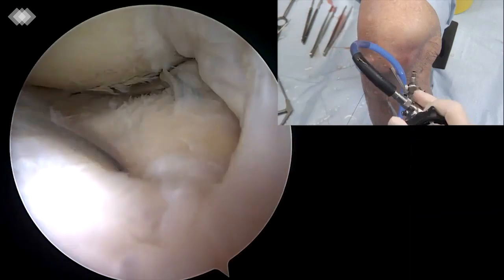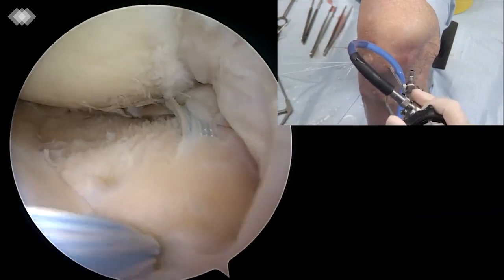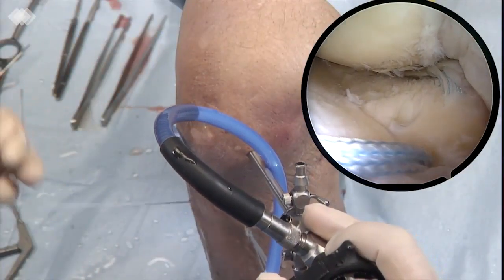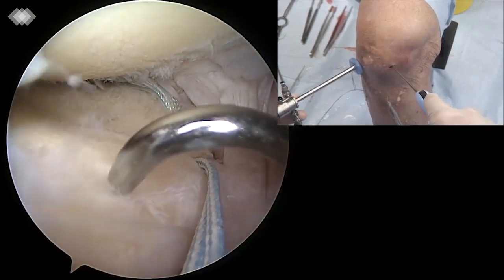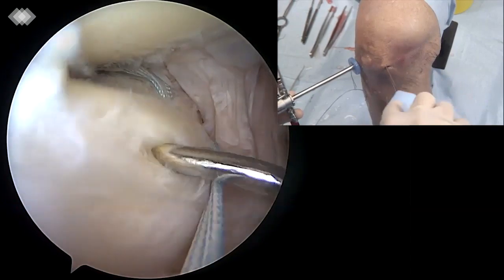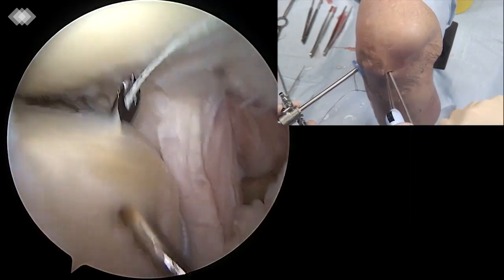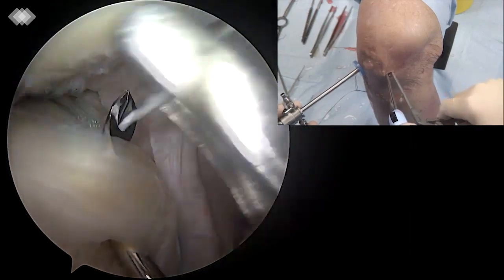A suture lasso with nitinol passing wire is passed through the tibial tunnel. The passing wire is recovered with a mini-shooter retriever through the anterior-medial portal. A fiber wire number 2 creates a loop shuttle and passes down the tibial tunnel. The fiber wire loop is maintained out at the anterior-medial portal while the two extremities pass through the tibia.